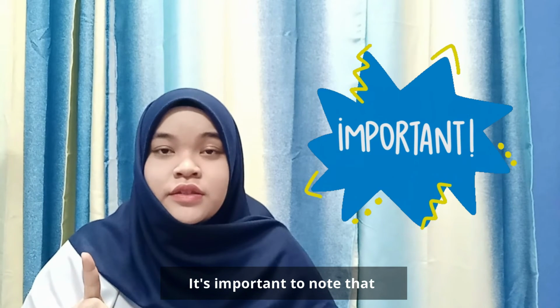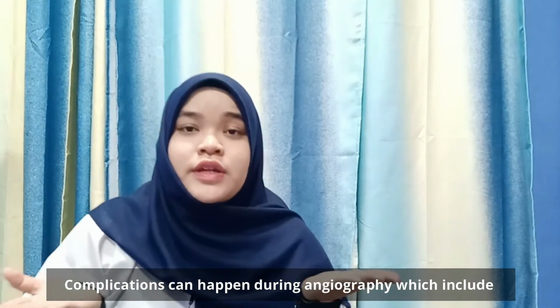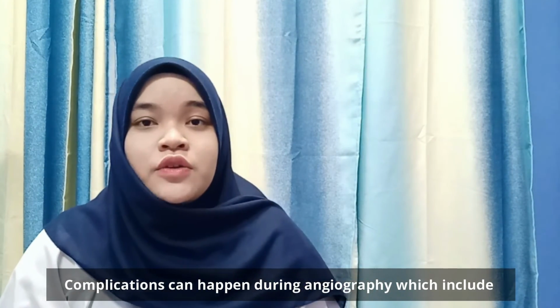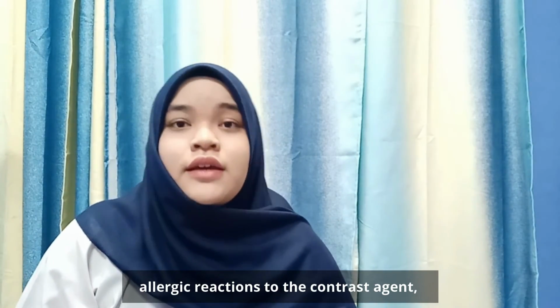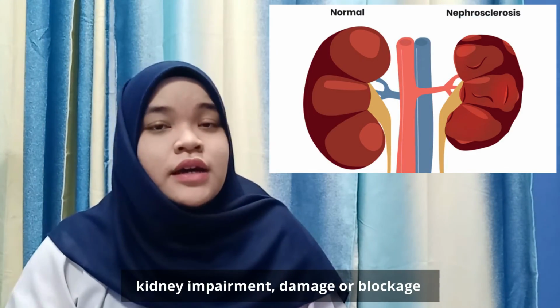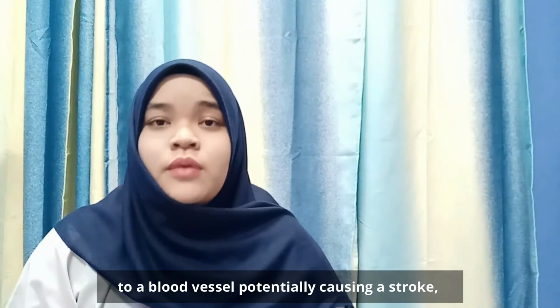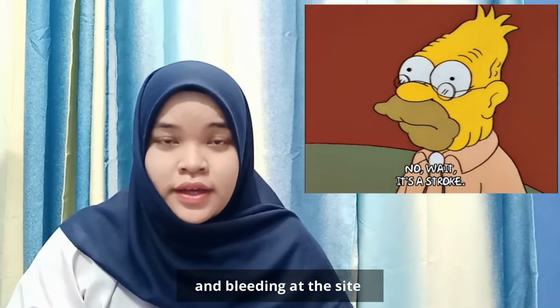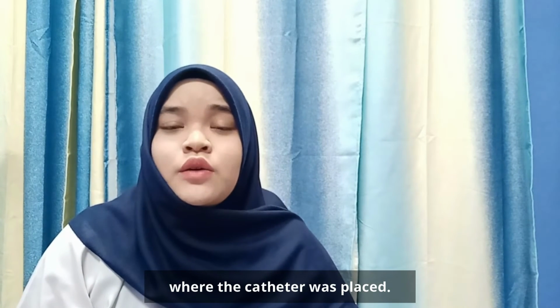It's important to note that complications can happen during angiography, which include allergic reaction to the contrast agent, kidney impairment, damage or blockage to a blood vessel, potentially causing a stroke, and bleeding at the site where the catheter was placed.